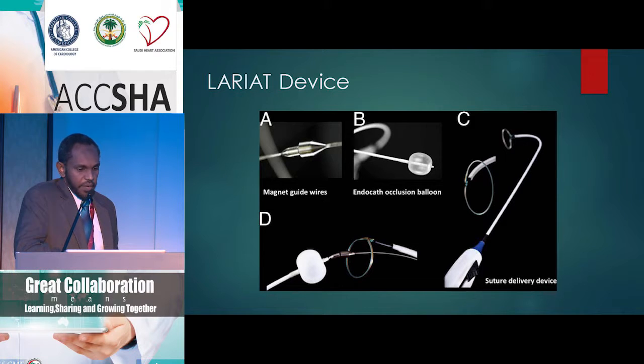I'm going to talk a little bit about the LARIAT device, which is a little bit different. The LARIAT device requires both transseptal access and percutaneous access through the normal pericardial space, which has little fluid. So it does carry the risk of entering the pericardial space, which is commonly done these days by electrophysiologists who are doing epicardial ablations.